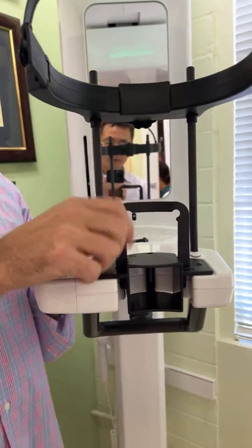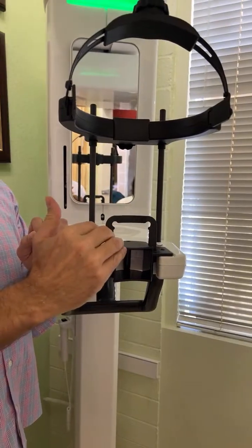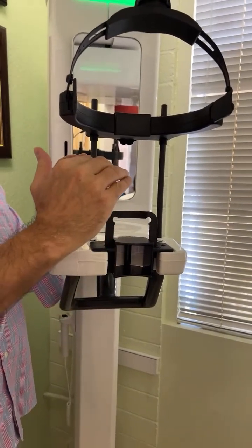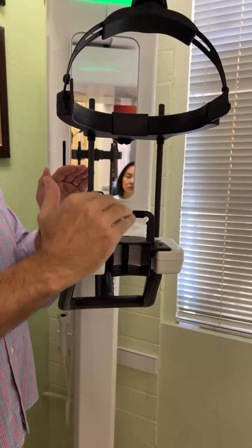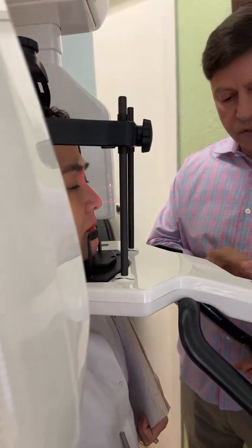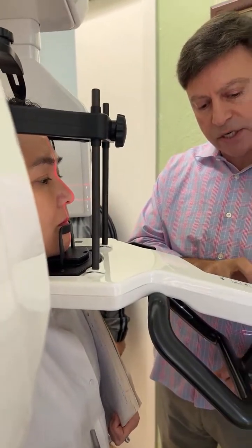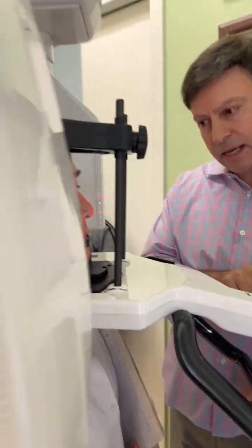Okay. And you'll notice you just took away that height that was there, right? That is under the chin. And that's going to allow me to raise the machine up now where that space is gone. For example, I'm standing here, then the chin. Okay, what I would do now is raise them. You guys haven't seen this yet, but this is your touch screen. So you have a Z carriage. This moves the carriage up and down. See that? And it lowers it.